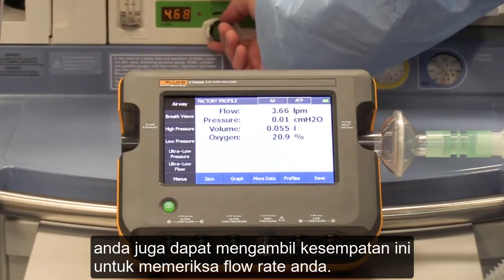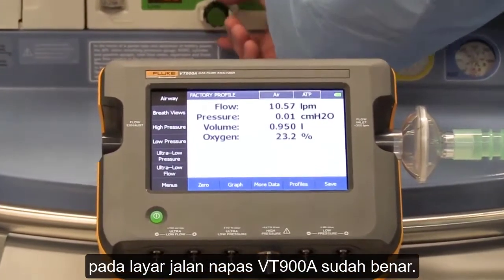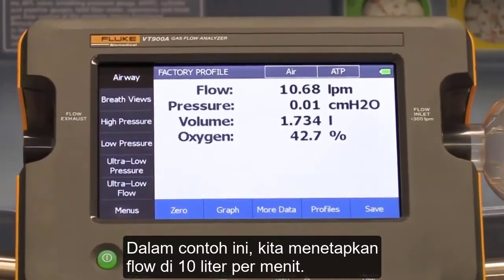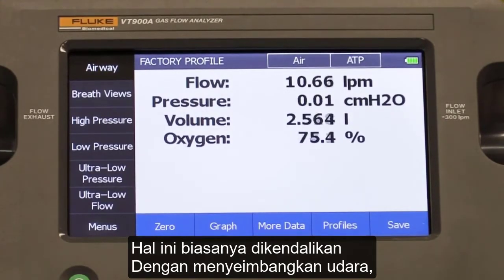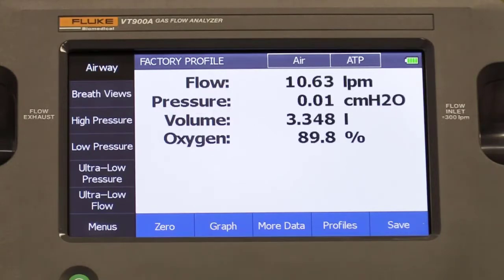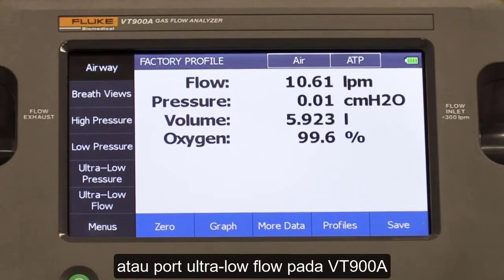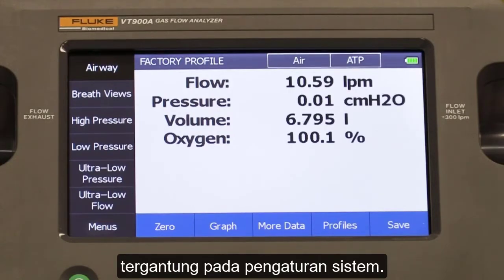You can also take this opportunity to check your flow rates. Set the flow rate on the anesthesia machine and verify that the setting on the VT900A airway screen is correct. In this example, we set the flow to 10 liters per minute. This is typically controlled with a balance of air, oxygen, and nitrous oxide to achieve that flow. You can also use the ultra-low pressure or ultra-low flow ports on the VT900A to verify the function of your respiratory gas monitor, depending on how the system is set up.